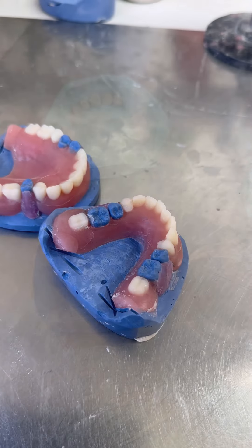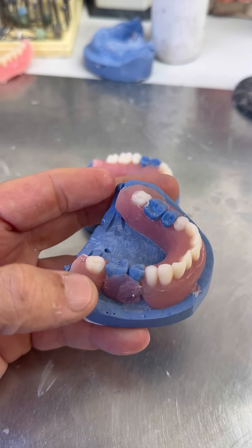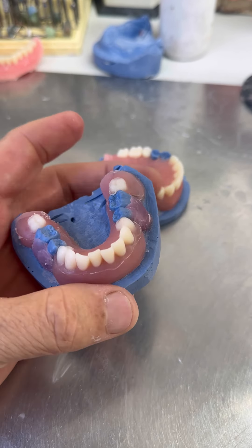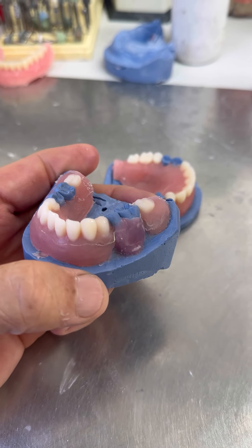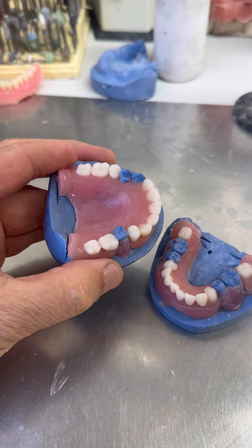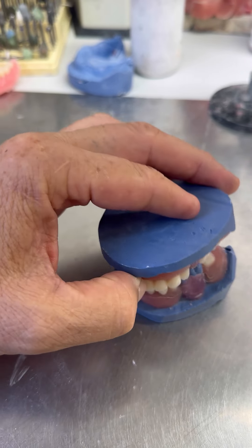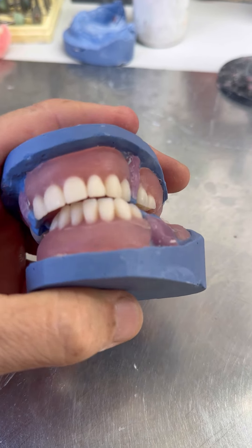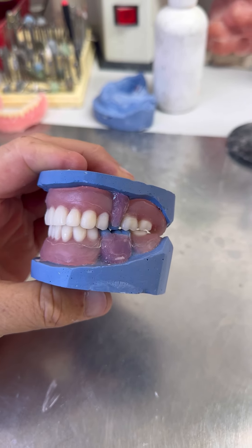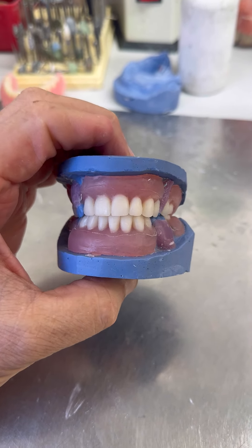Вот такая у нас получилась красота. Я уже тут литнички отрезал. Вот пролился весь протез хорошо. Теперь надо этот акрил ломать — он хрупкий, очень ломается хорошо. Снять модель, всё обрабатывать. Вот он, верхний протезик. Красиво, всё хорошо.